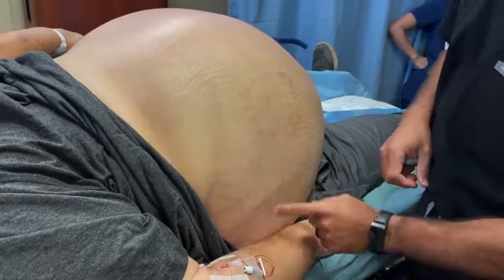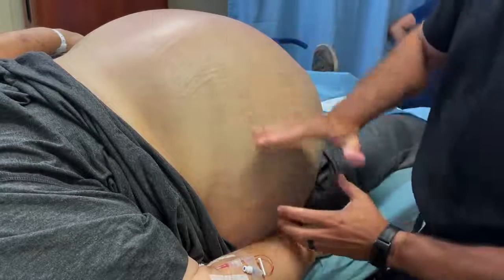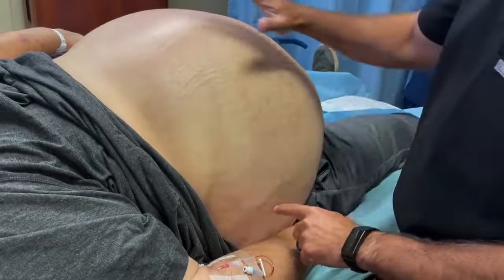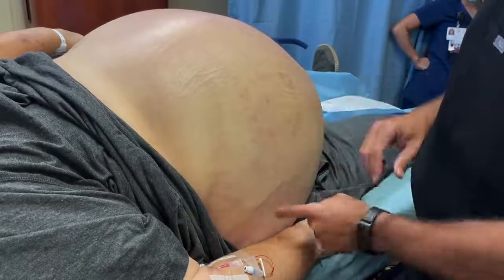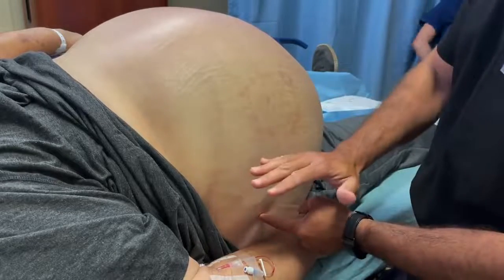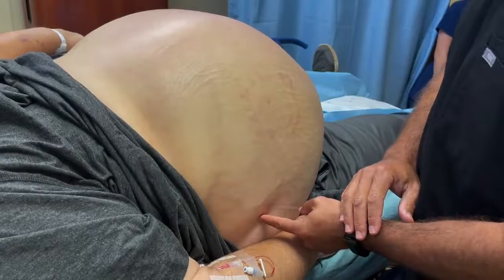We already performed an ultrasound showing that this area here has a large pocket of fluid. You want to pick the lowest area so that when the catheter enters and it lays down, you're able to catch most of the fluid, because initially we're going to get plenty of fluid no matter where we go. But you want to make sure you catch the most as he lays down into the back part of his abdomen, the retroperitoneum potentially.